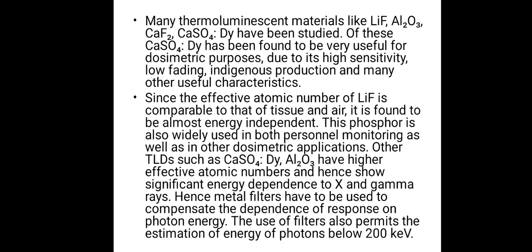Other TLDs such as CaSO4 and Al2O3 have a higher effective atomic number and hence show significant energy dependence to X-ray and gamma ray. Hence filters have to be used to compensate the dependence of response on photon energy. The use of filters also permits the estimation of energy of photons below 200 keV.